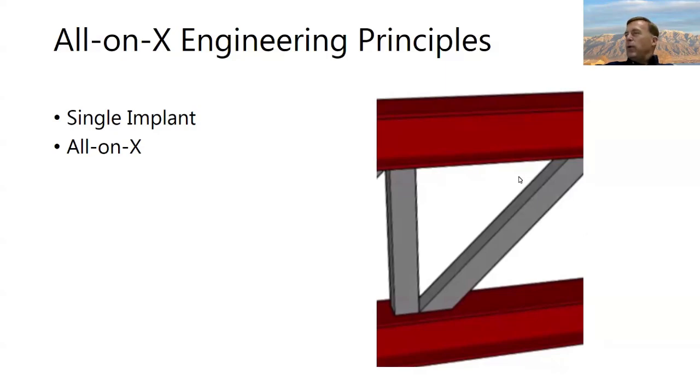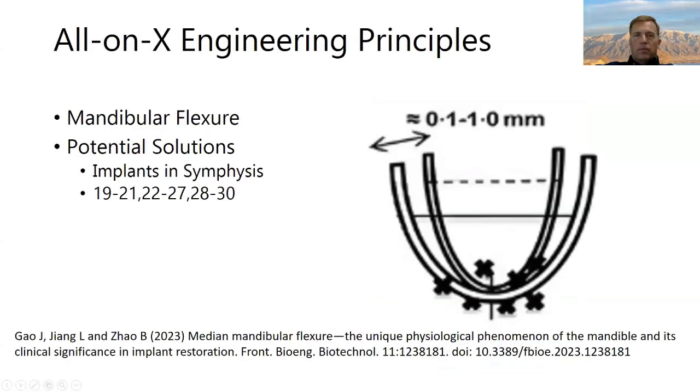And then the other thing I wanted to point out is, if you think of this as the prosthetic, if this is rigid, we're going to get no bending force on this implant, and we'll get a little bit of force this way, but we're not going to be trying to expand this. If we use a flexible material here, there's a potential for applying bending forces in addition to compressive loading. So saying all that to say that when you're choosing a material, if you choose a more rigid material in general, it's going to create a more favorable result long term.